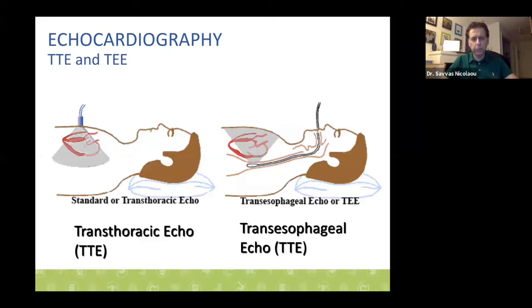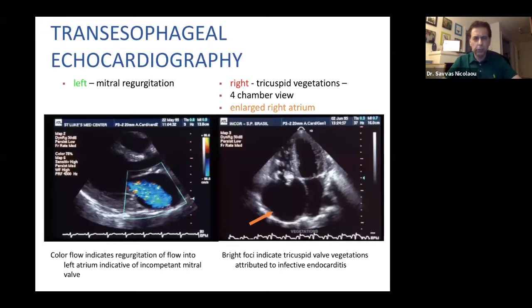Now, echocardiography: there are two ways to perform echocardiography, transthoracic and transesophageal. Transesophageal echocardiography, of course, being more invasive, carries with it some risks, such as risk of perforation of the esophagus, esophageal stenosis, and some cardiac arrhythmias. However, transesophageal echocardiography is always performed after initially performing transthoracic.